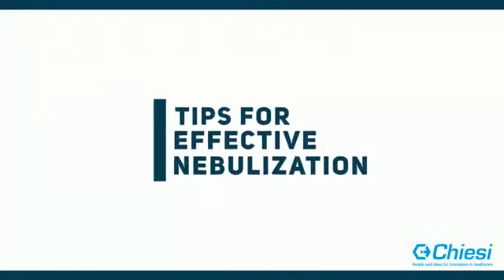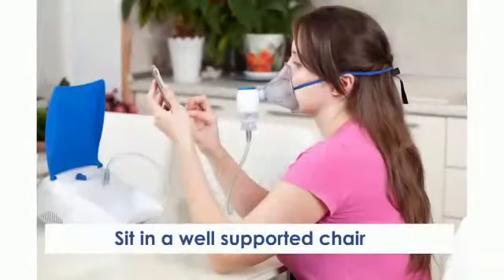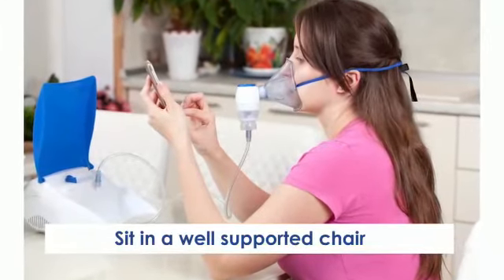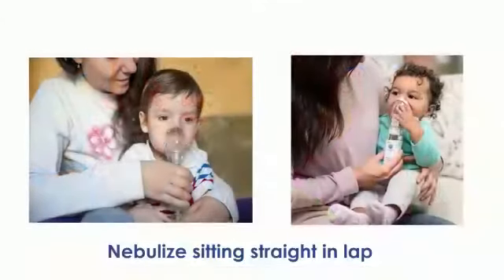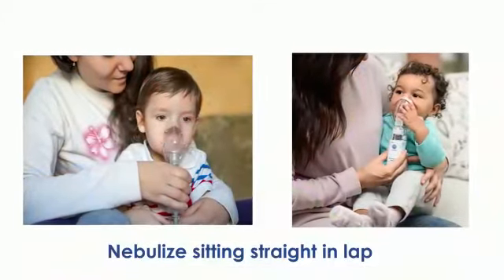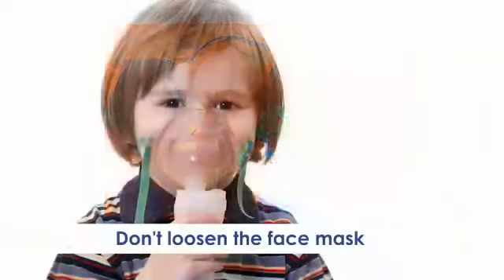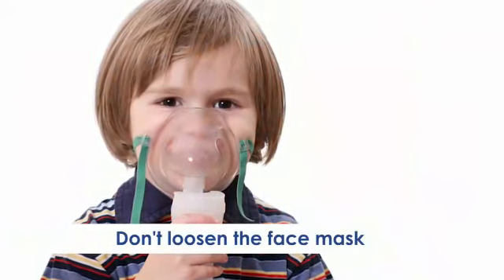Tips for effective nebulization. While nebulizing, sit in a well-supported chair with a neutral lumbar spine. In this posture, maximum medicine can be inhaled. Particularly, a younger child should be nebulized while sitting straight in the lap. It's better not to nebulize while sleeping. Don't loosen the face mask again and again. It may cause irritation in the eyes.